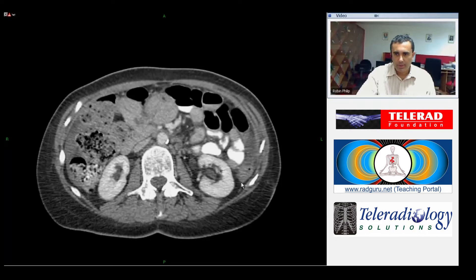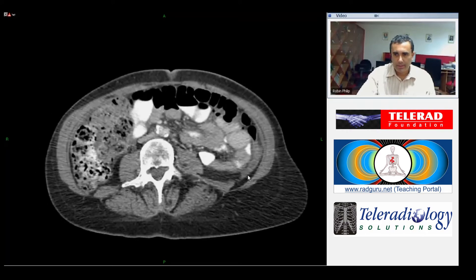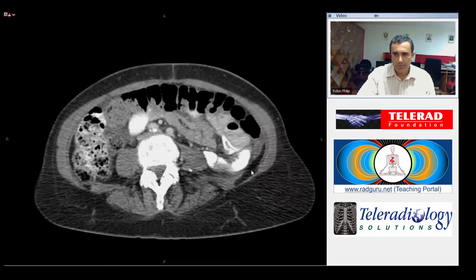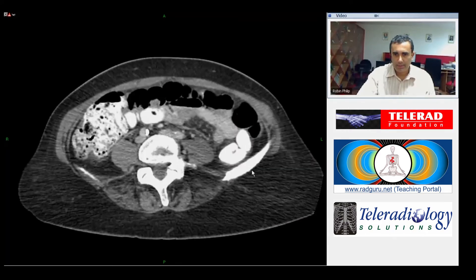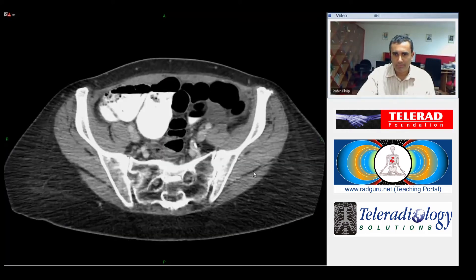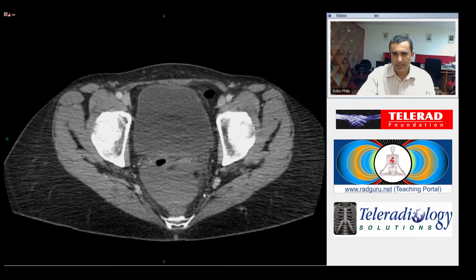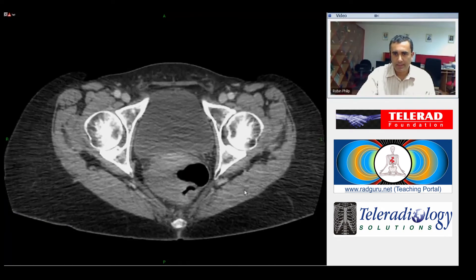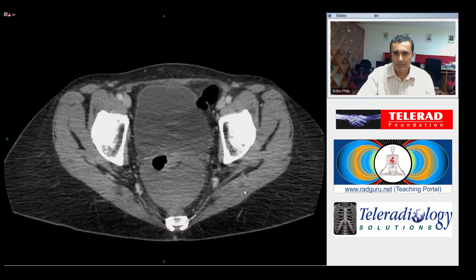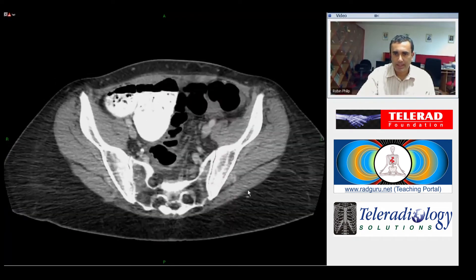As we follow the scan down, there is a small amount of fluid in the left flank as well, and there is a collection of fluid in the lower pelvis in the region of the cul-de-sac.